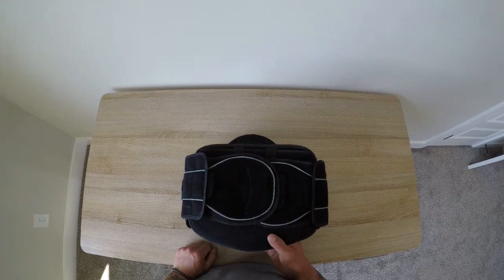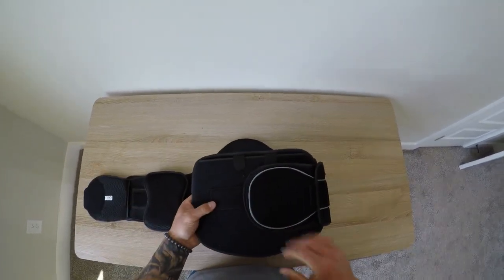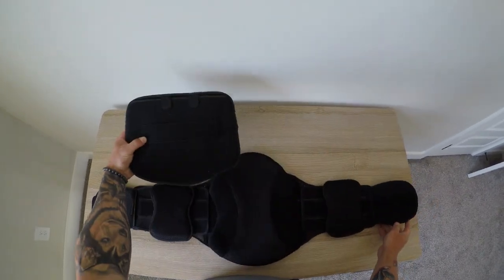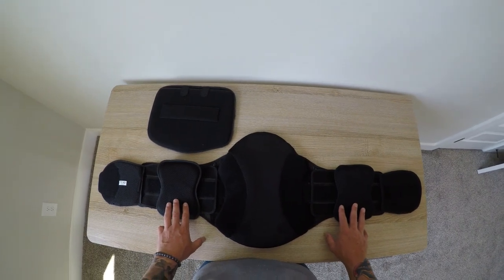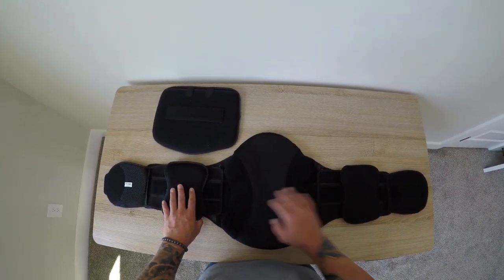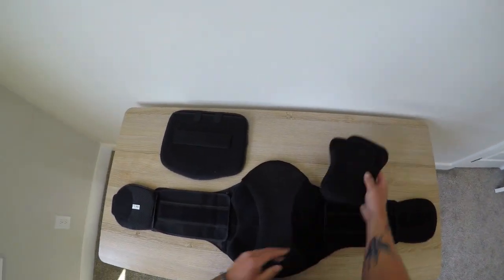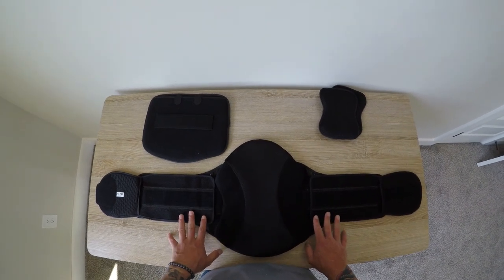This is our Trend Extend LSO. By opening the brace and removing this anterior panel, you'll see that we are left with the Trend Pro LSO — L0637, L0650. Removing the lateral supports, you're left with L0631, L0648. This is the Trend LSO.